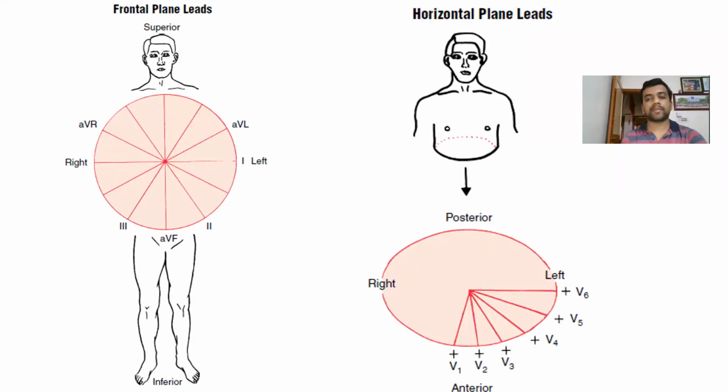They are like cameras, the ones which will determine the waveform. Starting with the first ECG wave which we drew, we discussed why that wave is formed, why that P wave comes and so on. Taking lead 2 as a standard, we drew one ECG wave like this, and we discussed all the mechanisms of why it is formed.